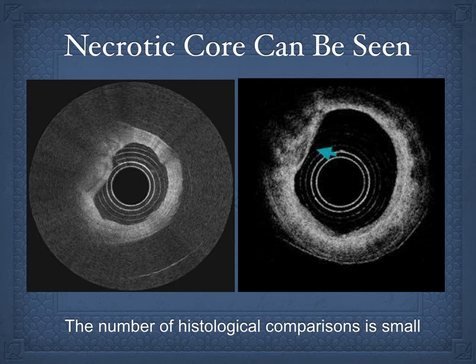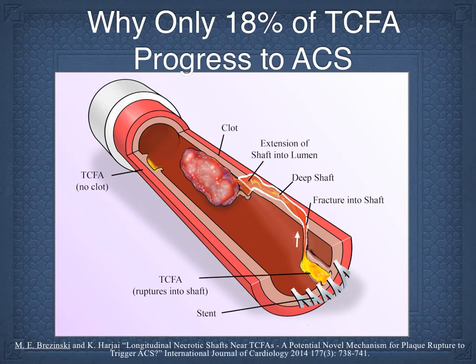That's random collections. This would not be from multiple scattering from the intima like we saw in that one original image in the previous slides. This is from actual structure within the necrotic core.